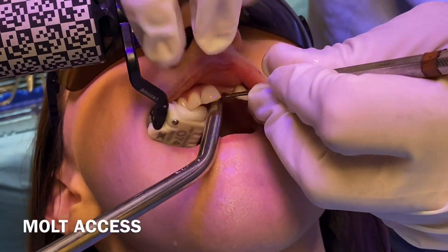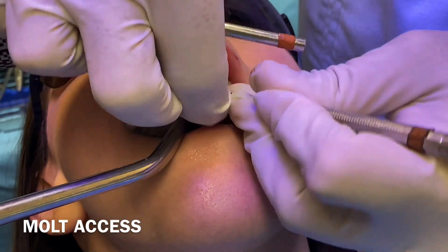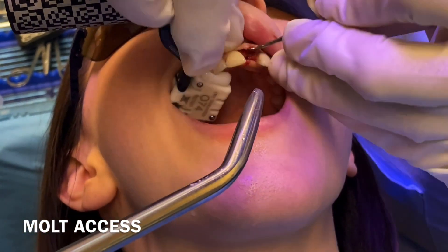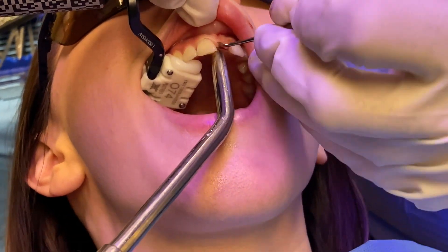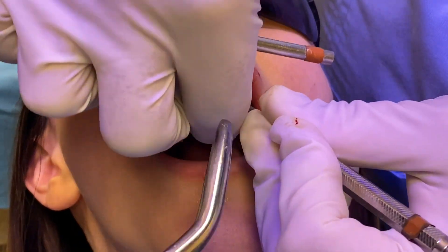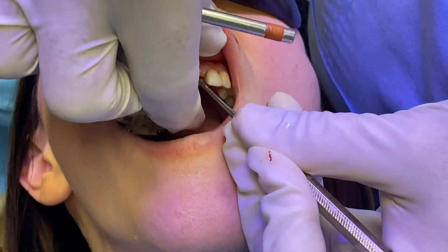You can see the X-Clip is in place with the patient tracker, and this allows us to work and know exactly where our hands are going to be when we're doing our drilling. As I flap, I'm just going to do a mini flap — I don't need to take the whole thing back too far.